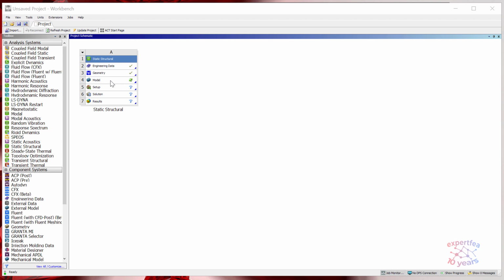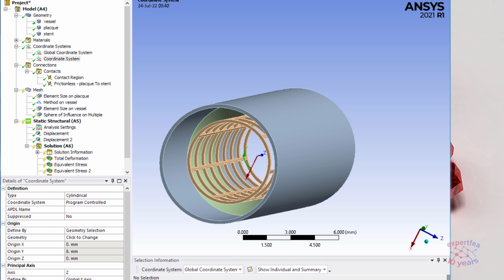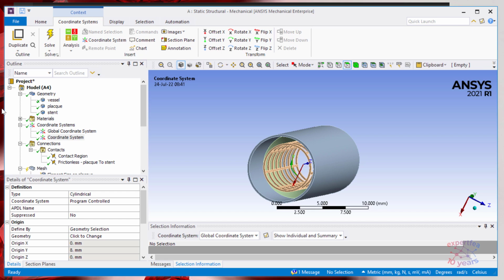So let's double click the model cell in order to insert the pre-processing details. I'll minimize this window for the moment. This is what just opened. No, not so much.